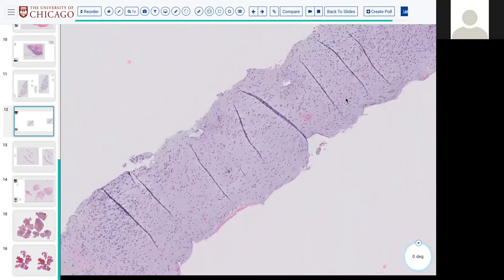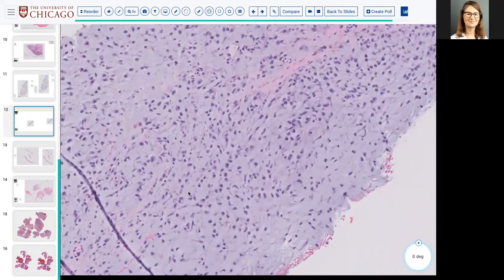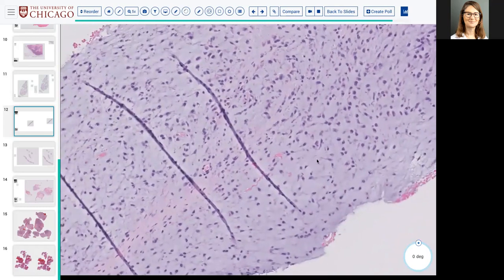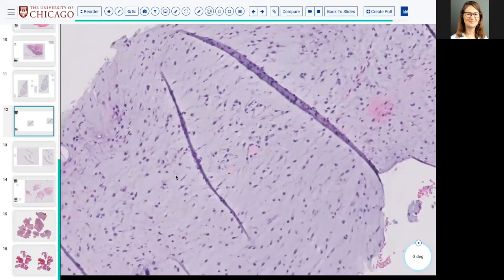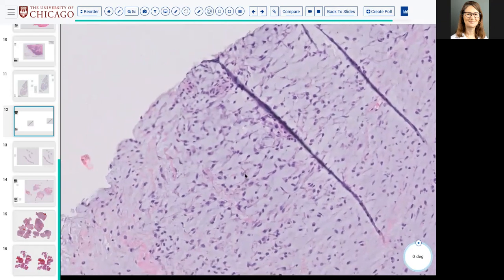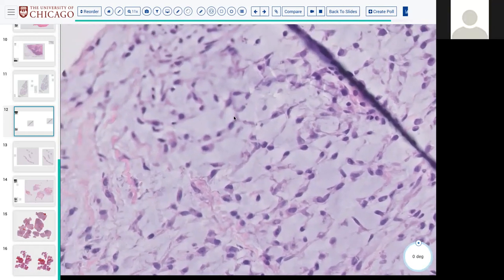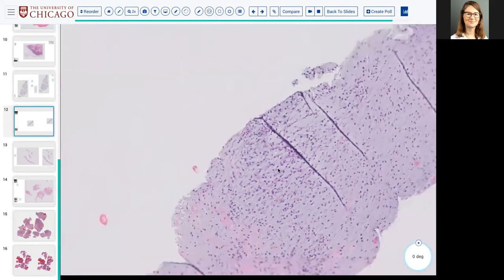Last time I read about this, I read that they had interconnecting cells. Is that what you meant by the ring of fire? Or do we just not appreciate that here? Yes. Interconnecting is probably a better word, but somebody once described them to me as holding hands, which I think I like. But yeah, they send these little bridges out to each other. And this is a nice area, but it's kind of behind the blur, right? There's a nucleus that's connecting to another right there. Almost chicken wiry, exactly, but it's not vessels, it's cells. Cool. What else?